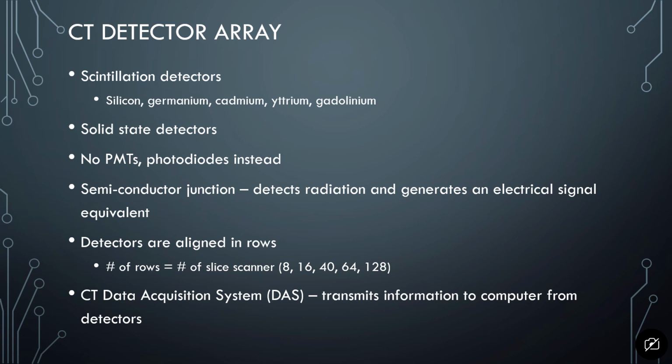They use photodiodes instead. Really, you don't need to know the energy of the photons. You just need to know that those X-rays pass through the patient and hit the detector. So you really just need to count counts, not analyze them, and photodiodes are great for that. It's going to tell you when the X-rays hit, and count them.